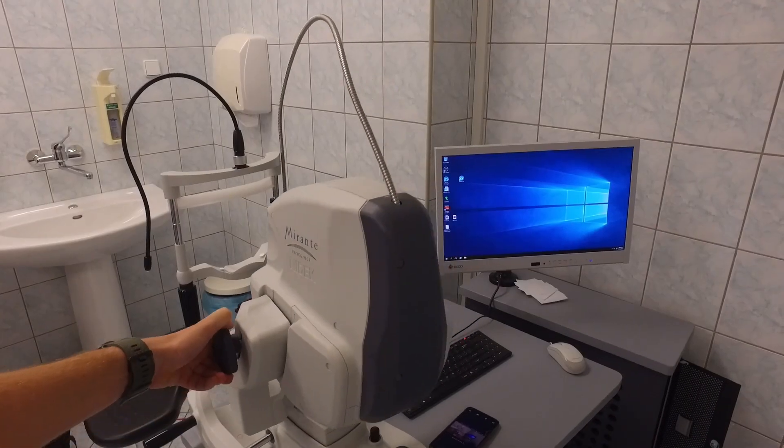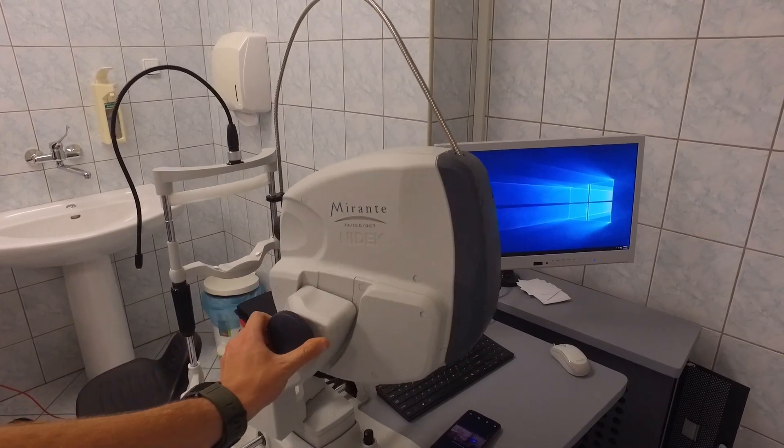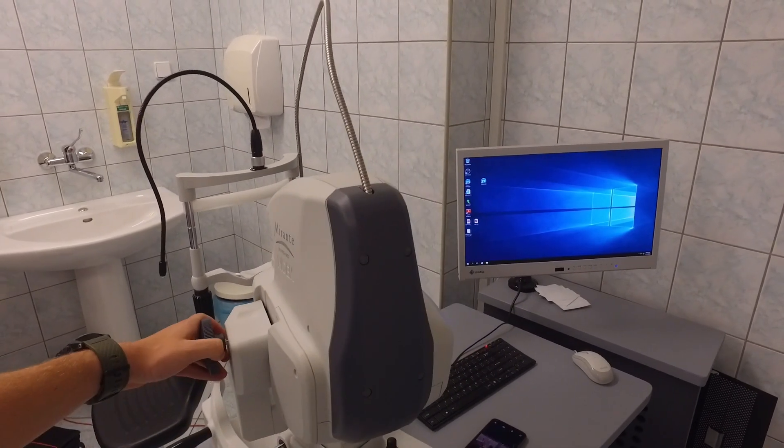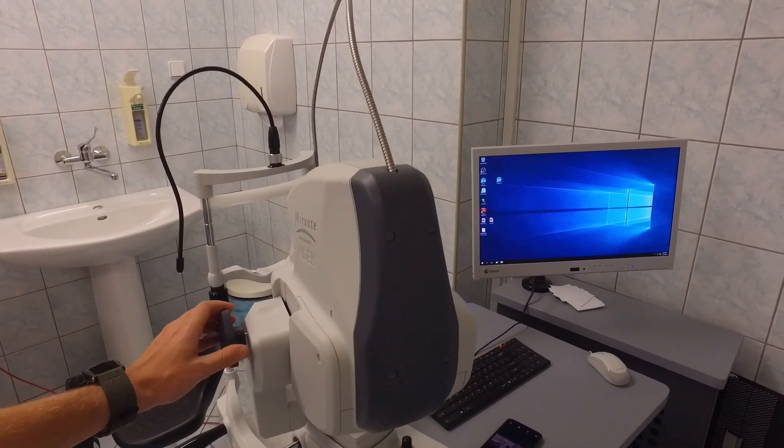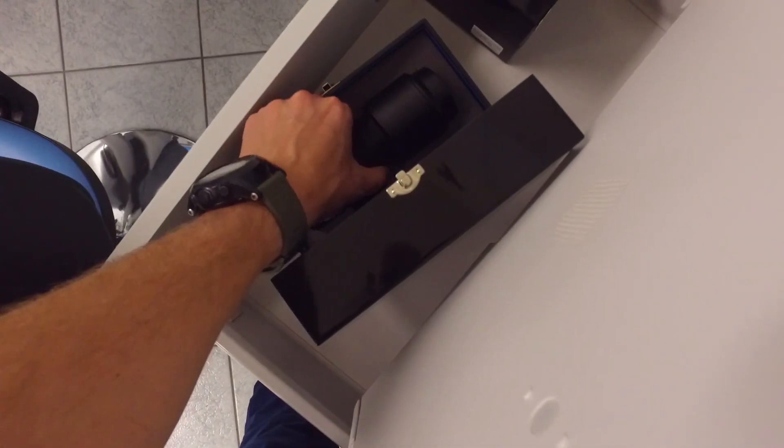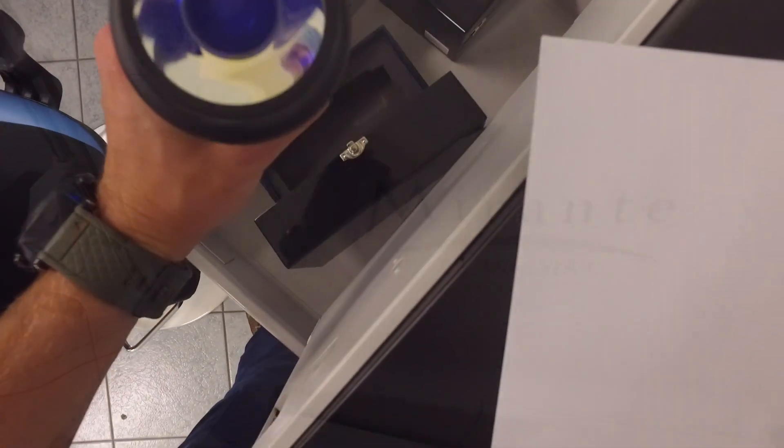A great feature about this machine is that it has a swivel rotation mode so you can move it up and down and right to left so even for uncooperative patients you can get nice images.